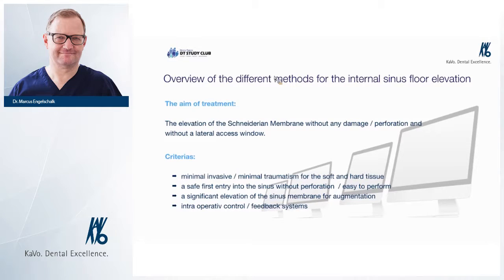Well, maybe right now your first question is, what is the height of bone I need to place an implant simultaneously? I would recommend not less than 4 millimeters. I learned 5 millimeters. Well, the daily experience taught me that we can perform it with 4 millimeters. If you want to be on the safe side, just take 5 millimeters as a residual bone.